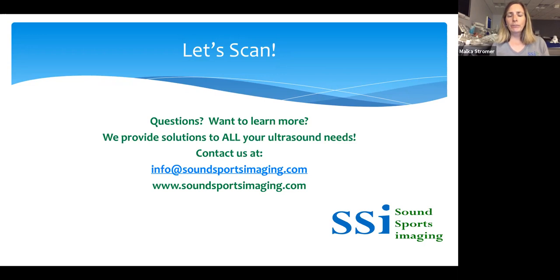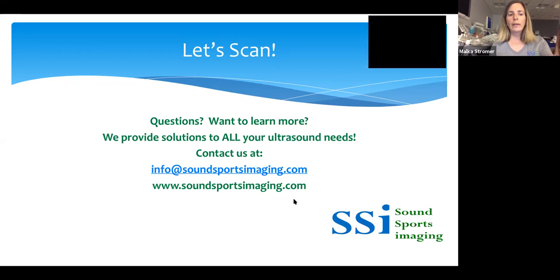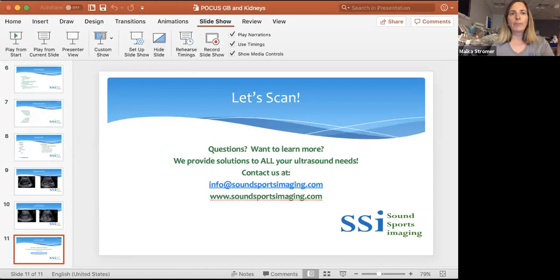If you have any questions throughout this webinar, please leave those to the end and we'll be happy to answer those. Right now, we are going to start scanning, and I will show you or demonstrate to you the way to visualize the gallbladder and the kidneys.